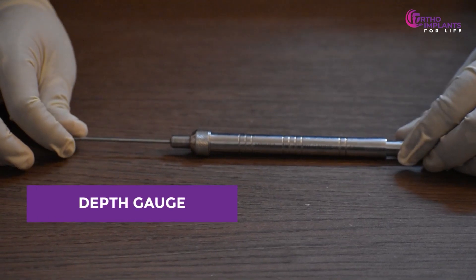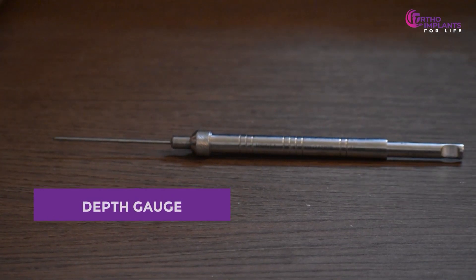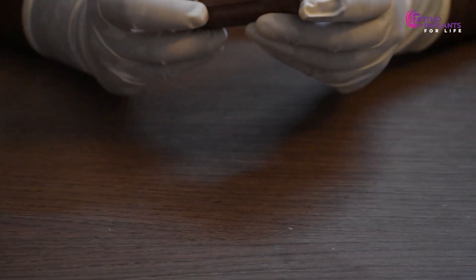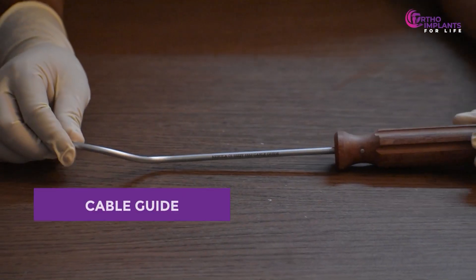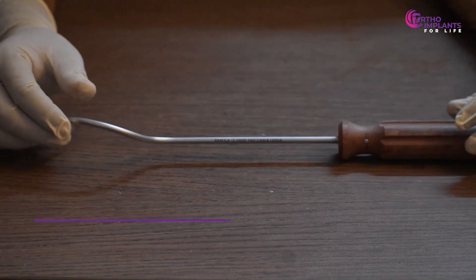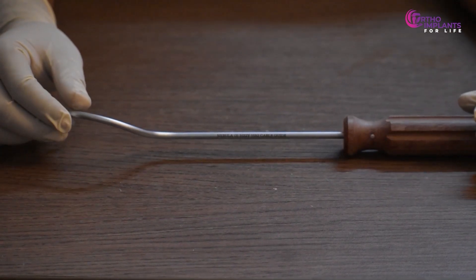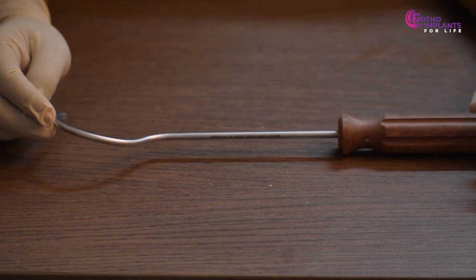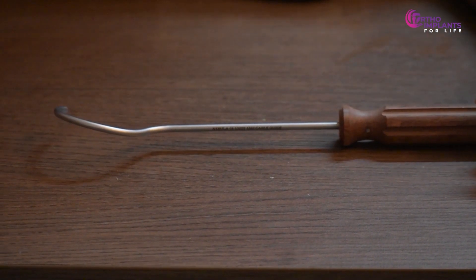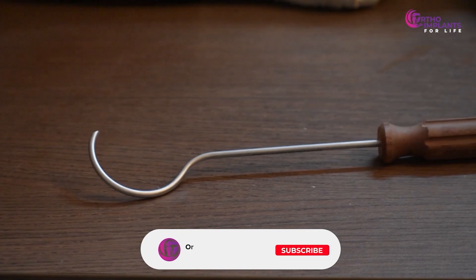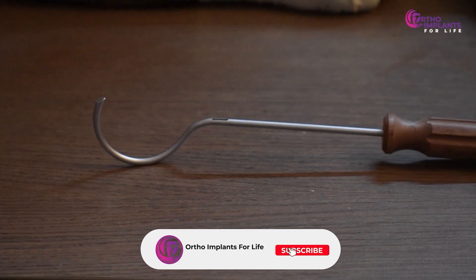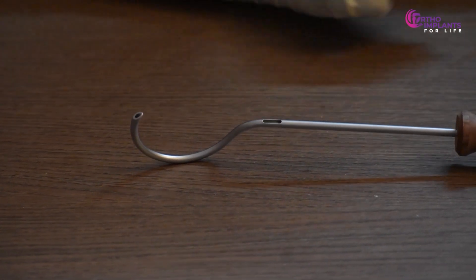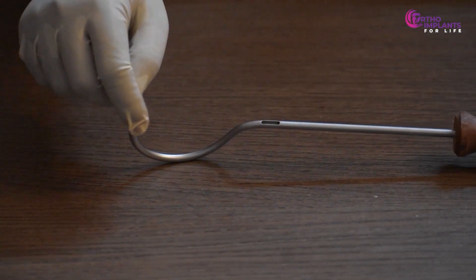This is called a depth gauge. Followed by the cable guide. This instrument is used to pass the cable around the bone and plate with ease. We use this hole in the stem area to pass the cable, and it comes out from this end right here.